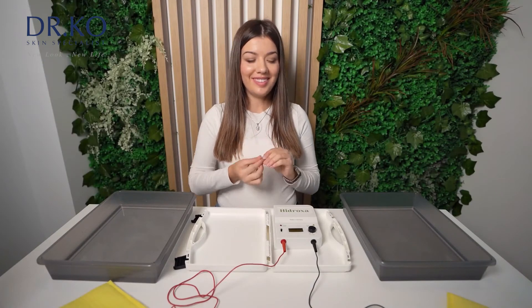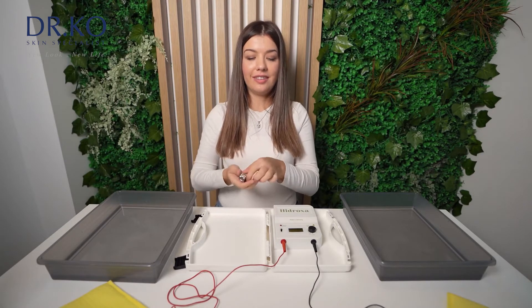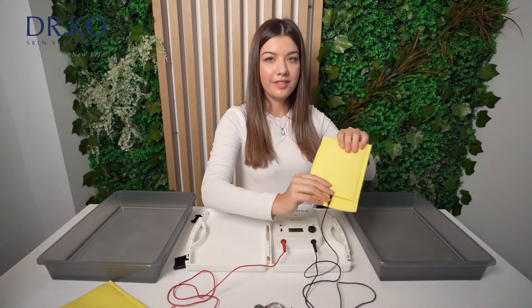Don't forget to remove all jewelry, piercings and clothing with metal details before starting treatment. Now, place electrodes in each container.